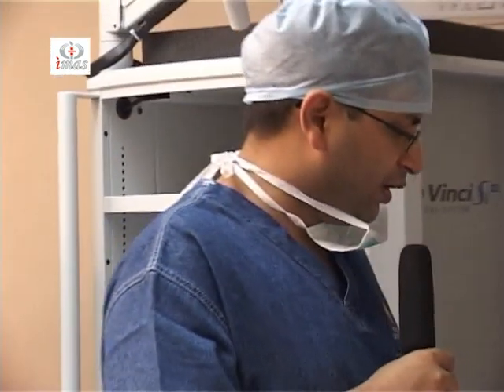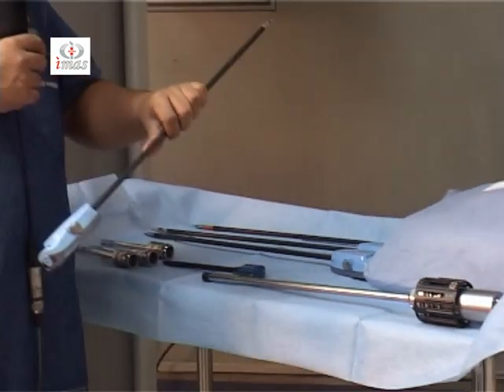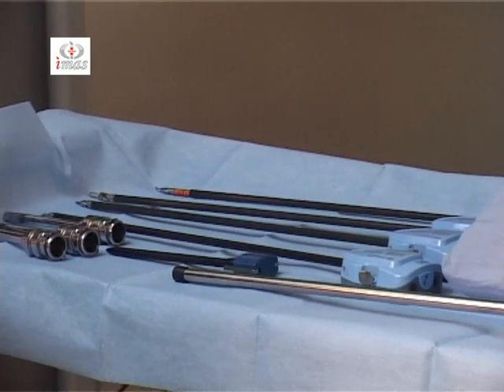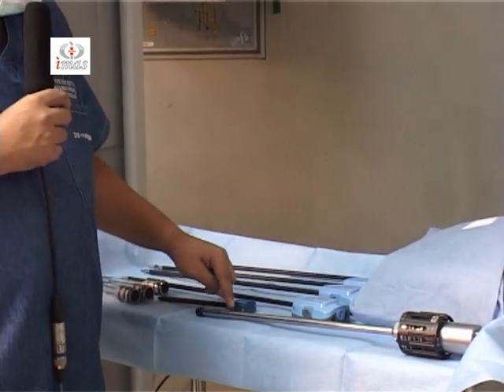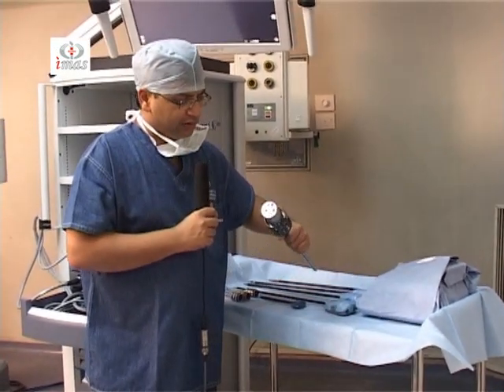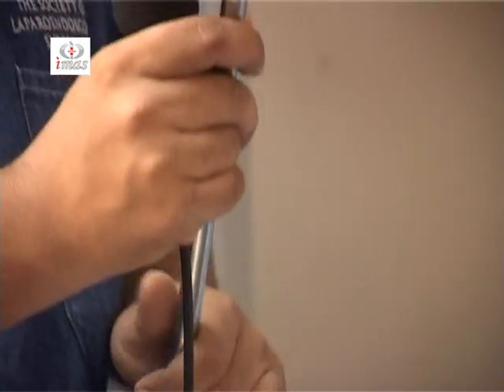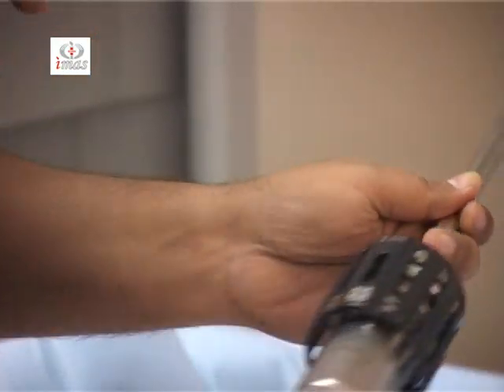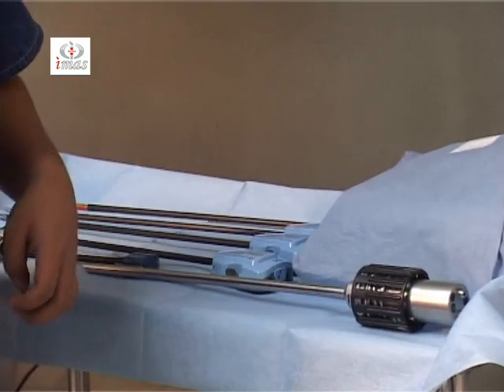And now these are the instruments for the robotic surgery. These are 8mm endo-wristed instruments which are kept for the robotic surgery. These are the 8mm Da Vinci metallic ports. This is the 30 degree stereo endoscope, in which you can see there are two scopes inbuilt within one scope, and there are two light sources coming at the end of the scope also. This is the obturator and these are the sterile drapes.